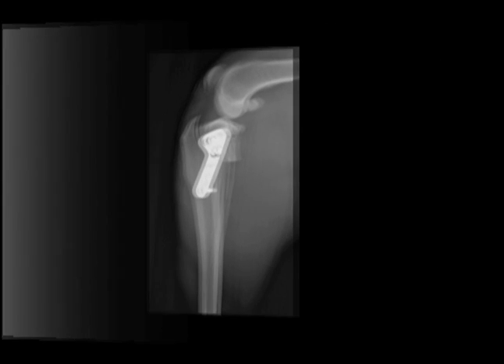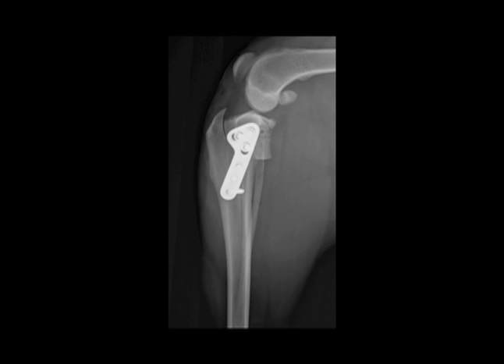And I have an illustration of that. So we move to the X-ray, and here we have an example of a level tibial plateau. We actually shoot for about 5 degrees, but a relatively level tibial plateau with the bone plate in place.